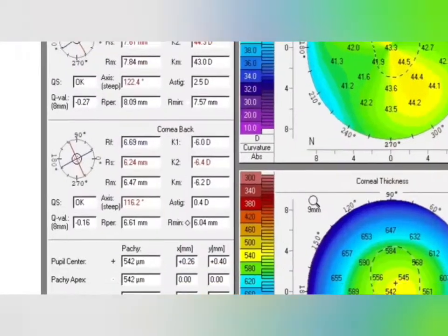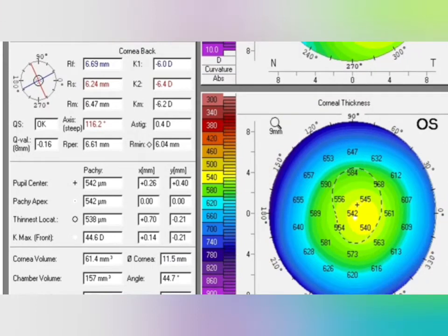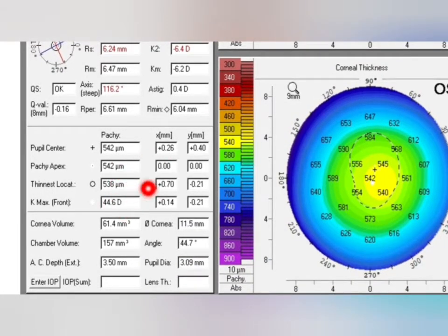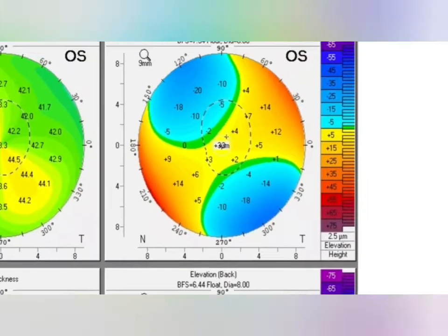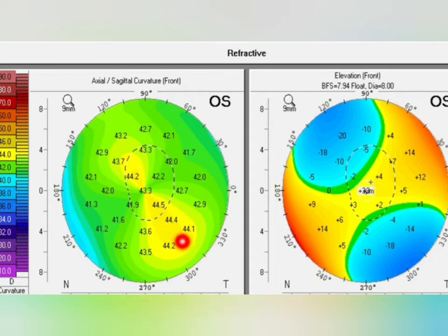Now let's move to the other eye. The QS value is normal. Q value, indicating asphericity of the cornea, is also normal. The Kmx value is 44.6 and the thinnest local is 538 — absolutely normal. Y-axis deviation is minus 0.21, also normal. The anterior sagittal map shows asymmetrical bow tie with inferior steepening, with the axis between 120 to 125 degrees. The difference between corresponding opposite points is less than 2.5, so absolutely normal.